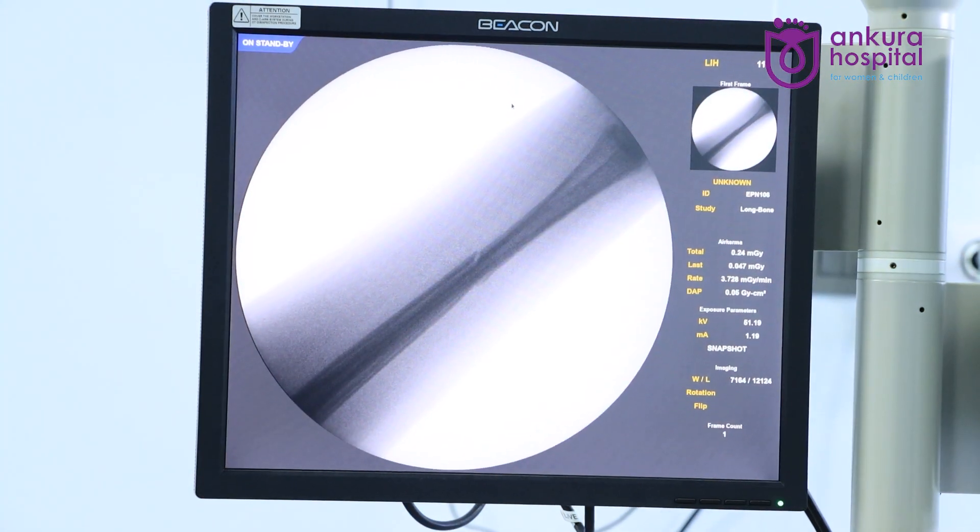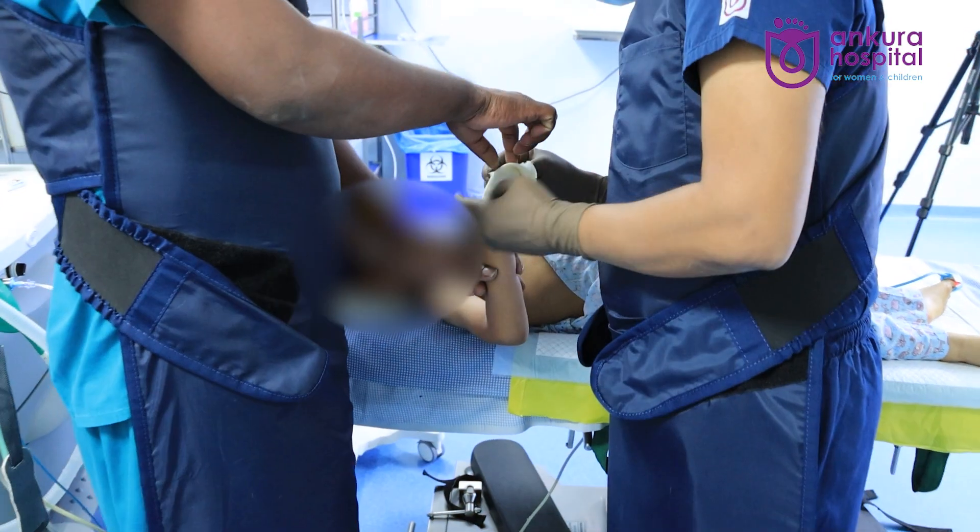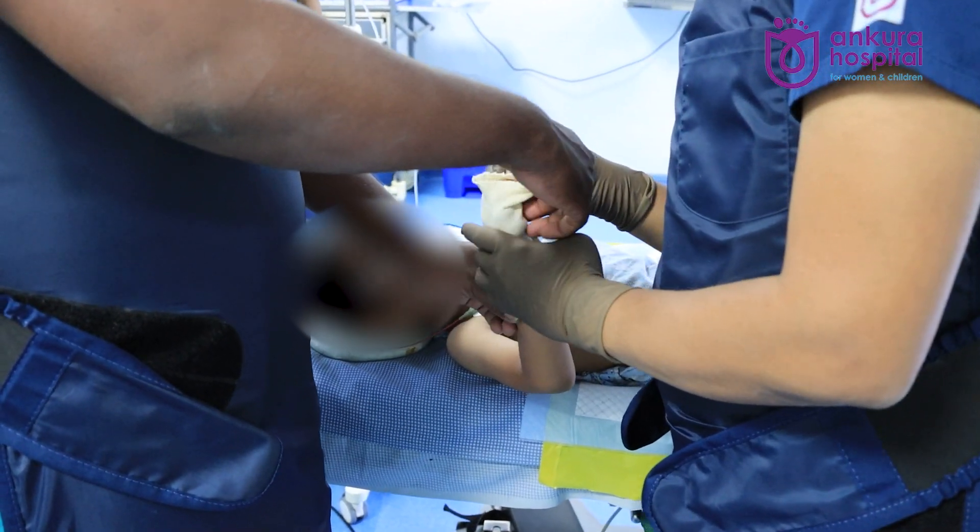We'll check the same on the C-arm now. The deformity is corrected.